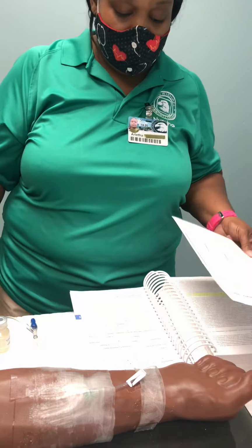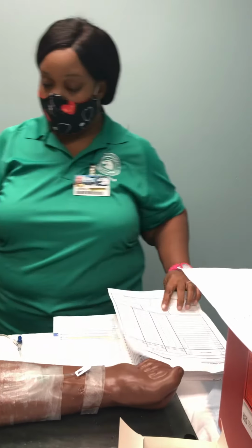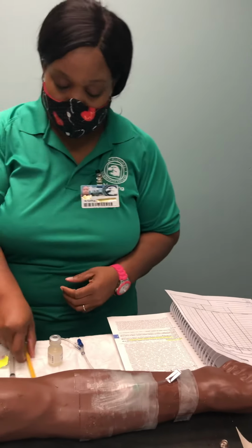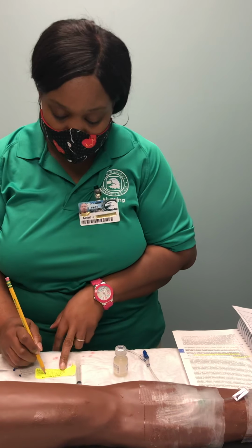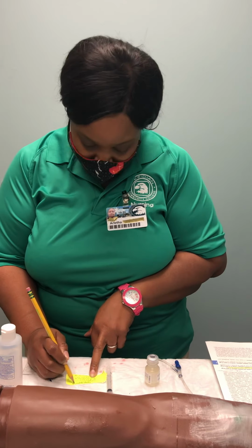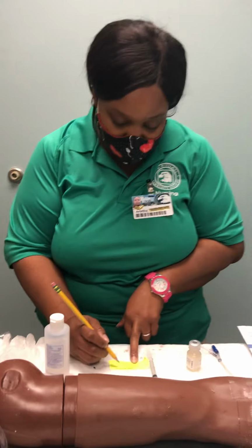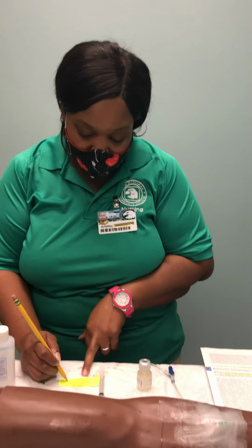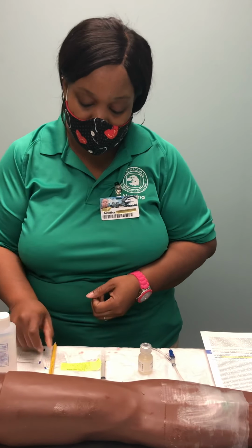Okay, I got that. So this is what I'm going to do: assemble all my equipment. I'm going to write on my label the patient name, the medicine, the amount, the time, the date, my name, the time it is going to end, and the date.